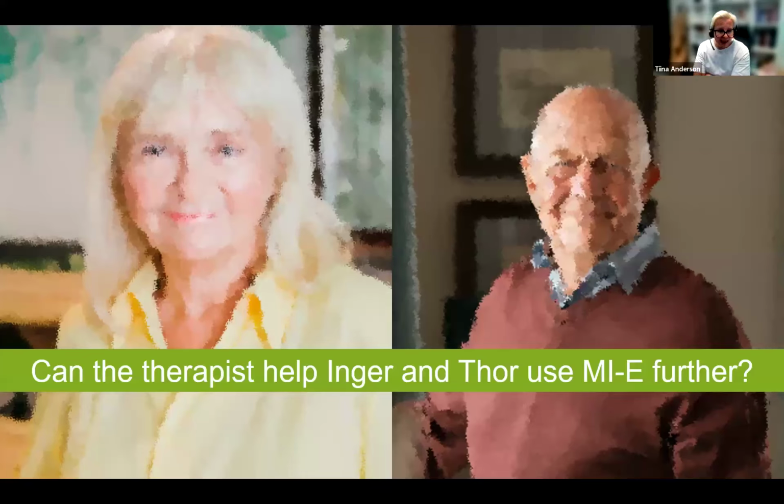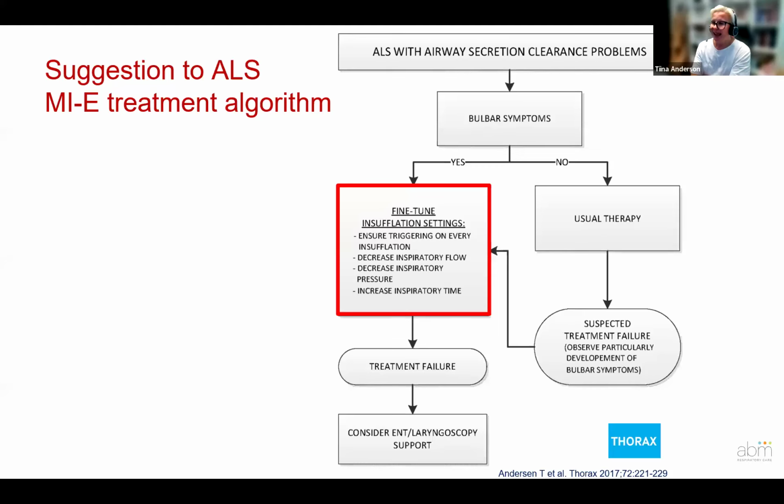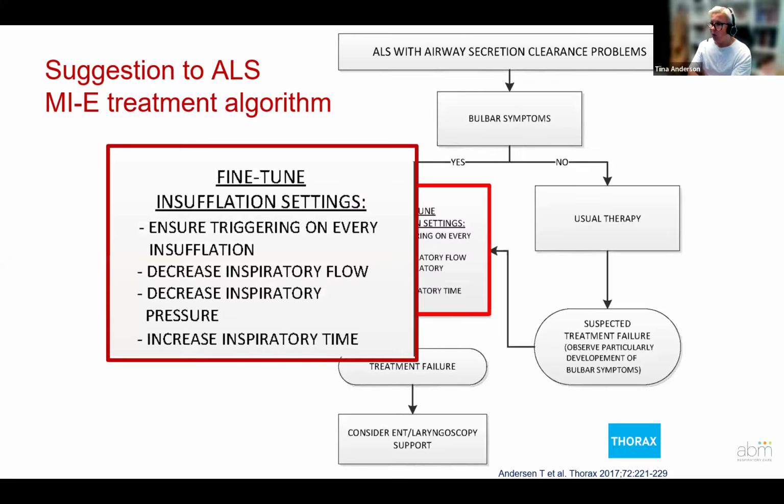Okay, can we still help Inger and Thor to use MIE further? Well, based on the observations we have done with the visualization of the larynx with different kinds of treatment pressures combined with different kinds of instructions, we recommend to first focus on fine-tuning the insufflation settings.